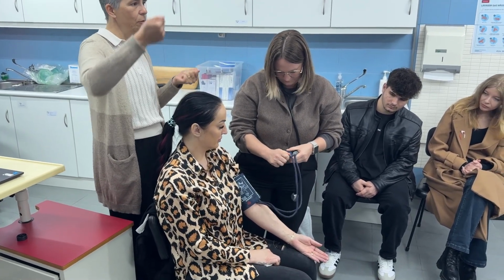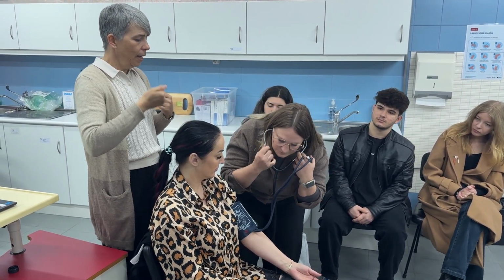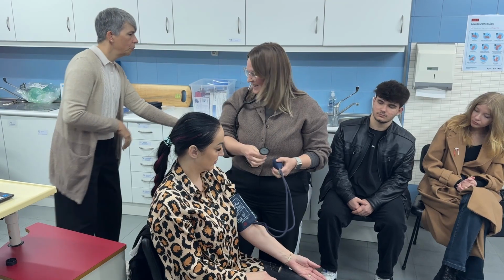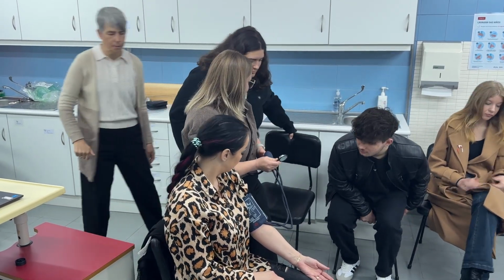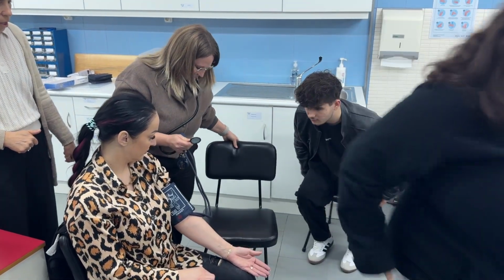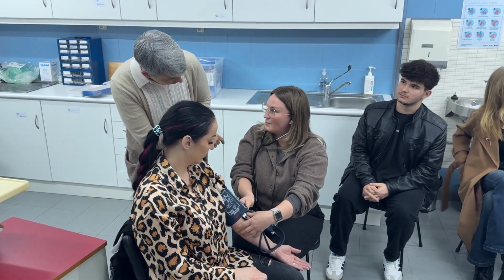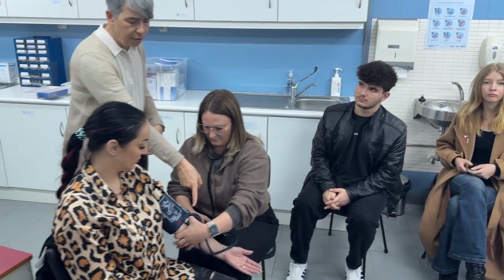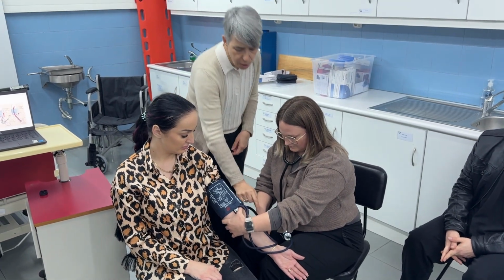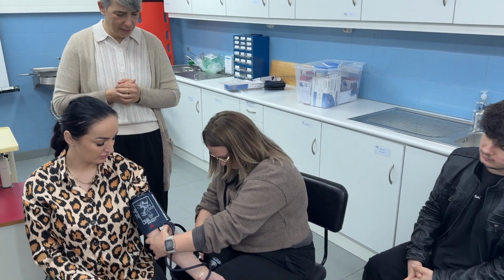And in fact, if you are right-handed, you should be able to take the balloon in your right hand and fix the stethoscope. You're sitting, maybe you can sit in her place, so you have some comfort. So she fixes the stethoscope with one hand and operates the cuff with her other hand.